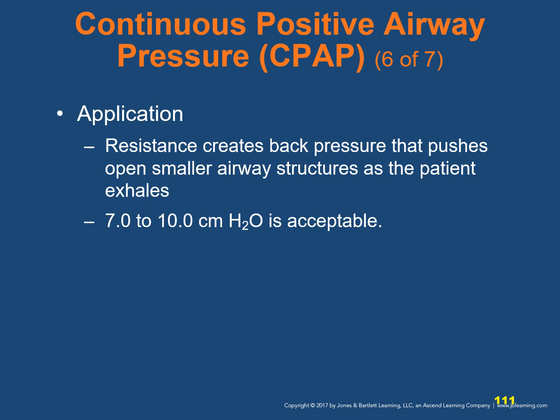A pressure of 7 to 10 centimeters of H2O is generally accepted as a therapeutic range. Most CPAP units are powered by oxygen, so it is important to have a full cylinder of oxygen when using a CPAP. Disposable CPAP devices are lightweight and relatively easy to operate. To use a CPAP, you'll practice this during skill drill 10-10.